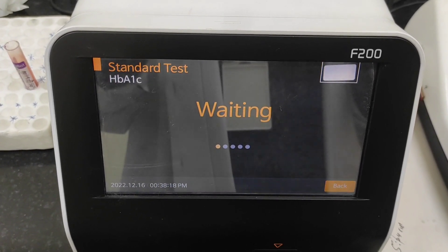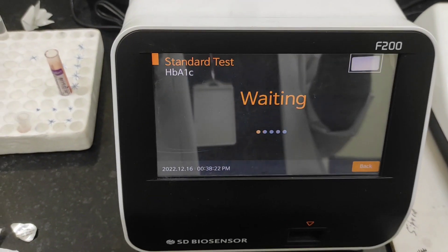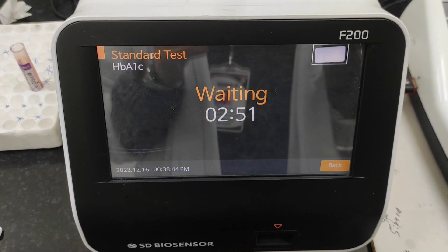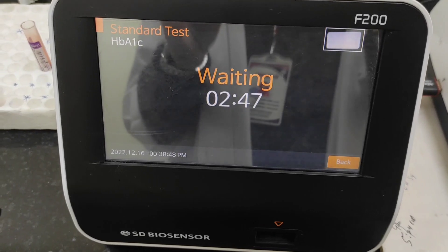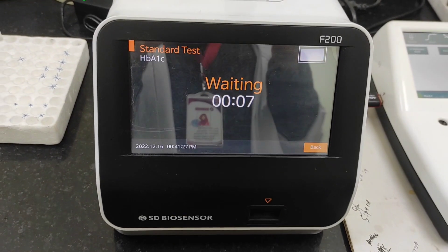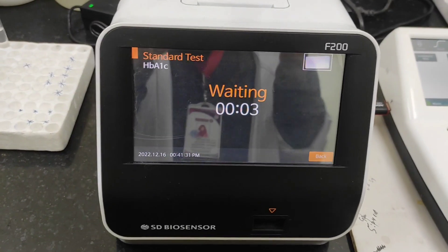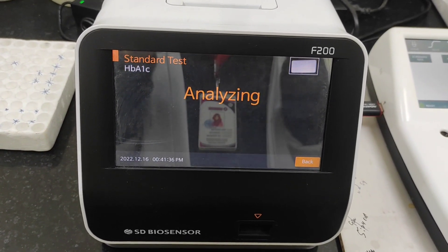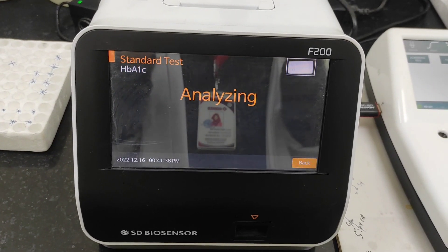It takes a bit of time — this is the incubation going on. After incubation is complete, it gives a beep alert to let you know the results are coming. The incubation is now over and it's analyzing the cartridge.